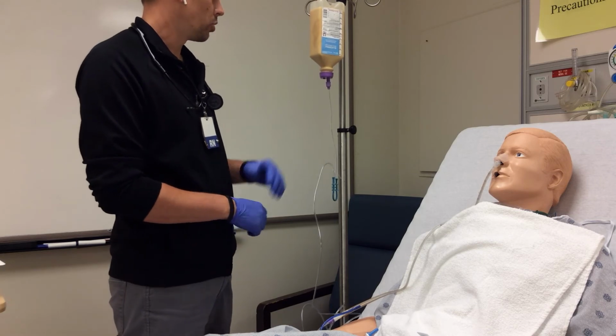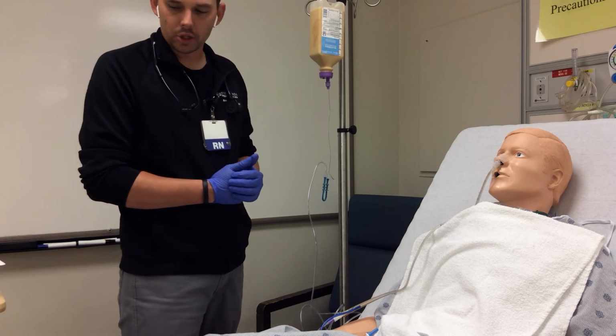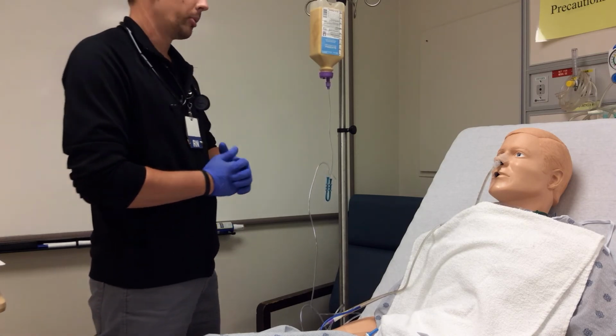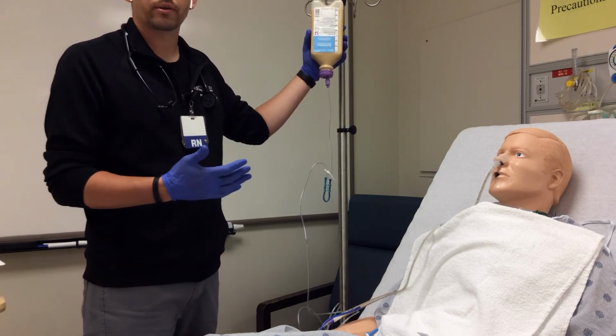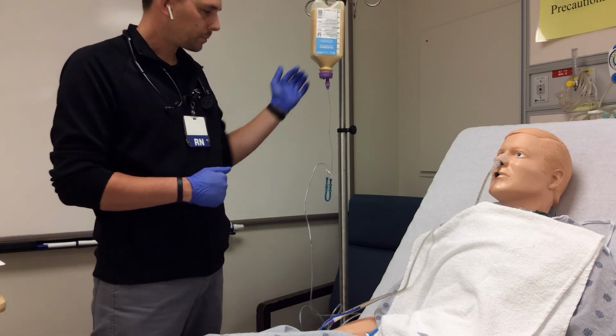Again, before we exit the room, we want to check on our pump to make sure it's going at the ordered rate by the physician. Some other things that we want to make note of is that usually these patients are going to be getting this for 24 hours a day continuously. That's why they call it continuous tube feeding.